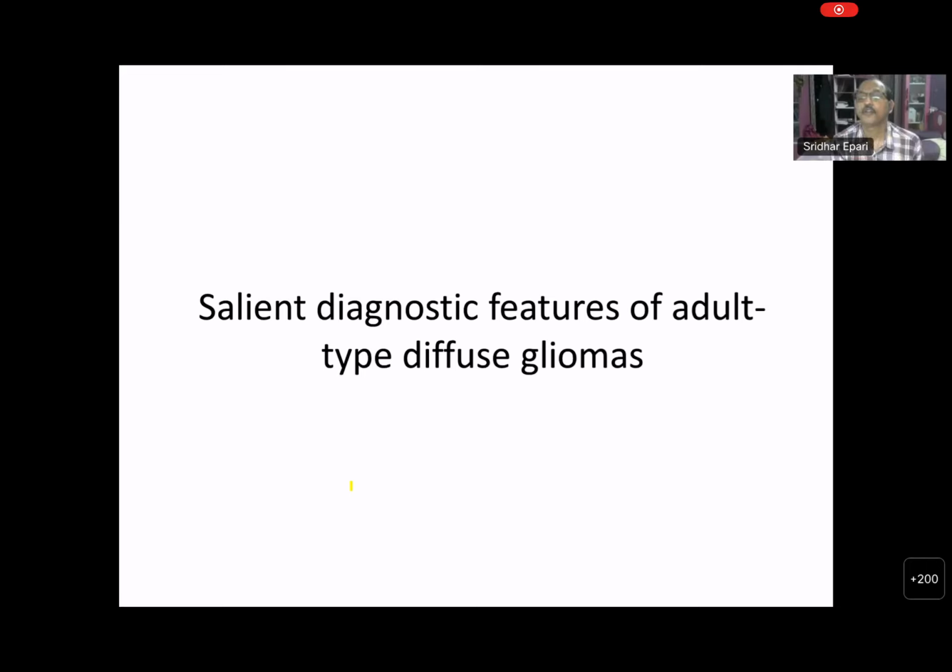So whenever you get a mutant protein positive, it tells you that it's an IDH mutant tumor. Because it's a mutation. The mutation caused the tumor. This is the tumor driver mutation. It will be present in all tumor cells. It cannot be present in only some cells. In glioma, IDH mutation is a driver mutation for tumorigenesis, both for astrocytic and oligodendroglial tumors. You cannot have some cells positive and some cells negative. When there are positive cells and also some negative cells, the negative cells are probably not abnormal cells. They might be reactive cells. So the answer is, reactive gliosis is never positive for IDH1 R132H if you're using a mutant protein IHC.